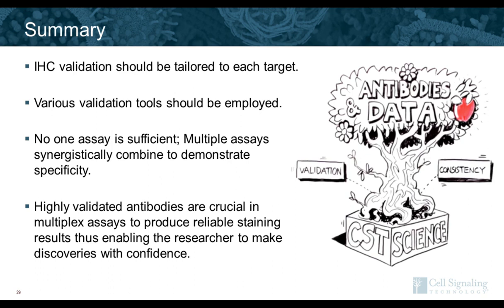Can I use an antibody created in a species other than mouse or rabbit, for example, rat? Yes, you can. Basically, with the OPAL technology and the OPAL kits, you can use an antibody that was raised in any species.